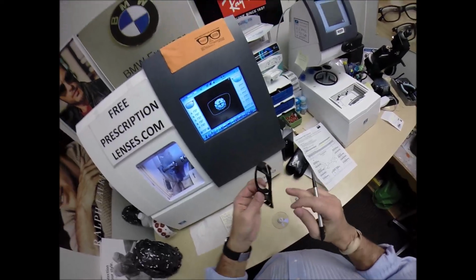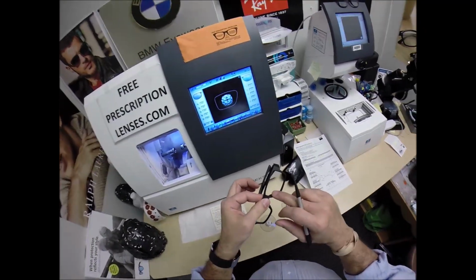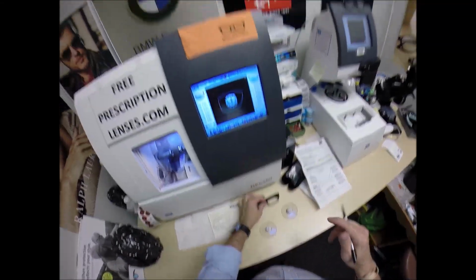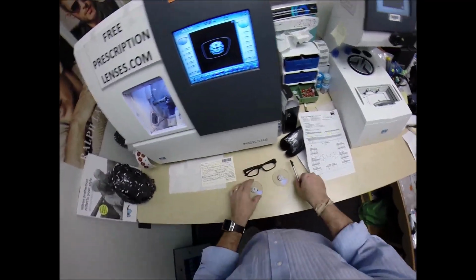As you will see in just a moment, even though no portion of this lens can protrude from the back of the frame, I still like to put it on there because I press the lens into the frame. I do not want any rough edges left over from the cutting cycle to come into contact with your frame.